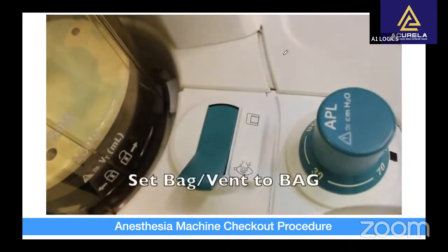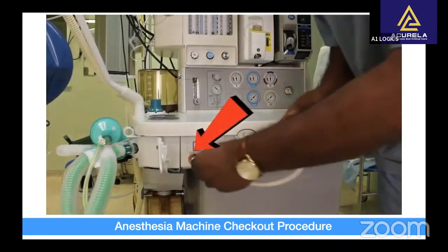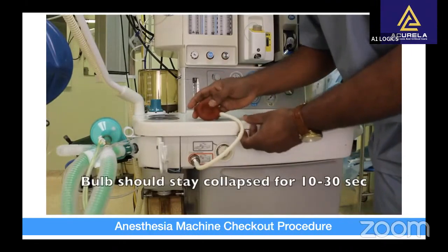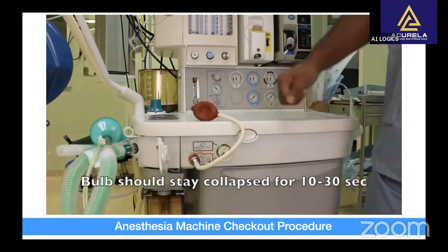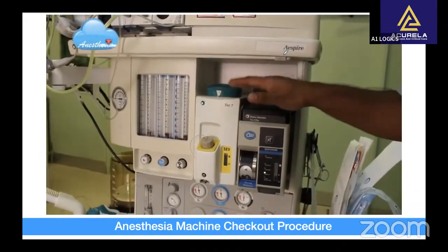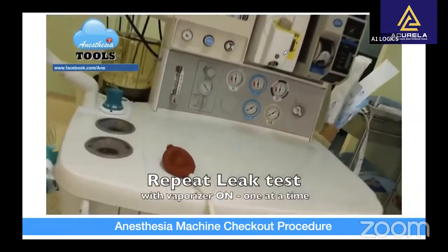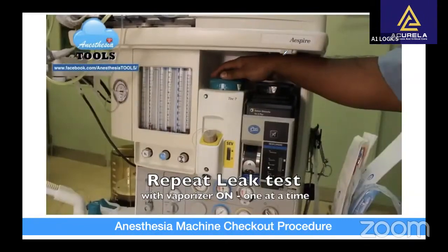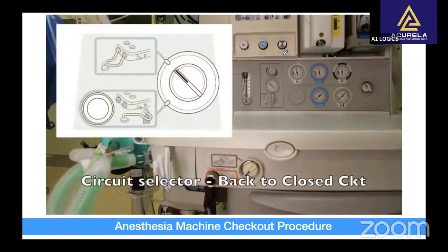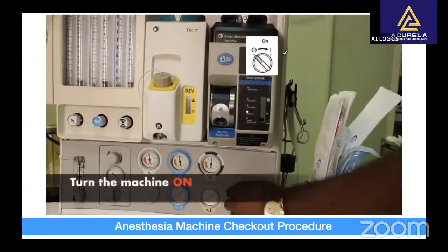Change the bag selector switch to bag mode. Change the circuit selector to auxiliary circuit and then attach the leak test device. Squeeze repeatedly so that the bulb is collapsed and make sure that the bulb stays collapsed for at least 10 seconds. You have to repeat the low pressure leak test after opening each vaporizer one at a time. After the leak test, see that the circuit selector is switched back to closed circuit mode. At this stage, you can turn the machine on.